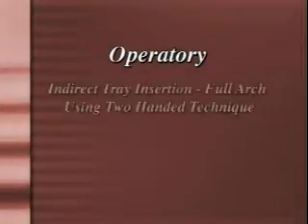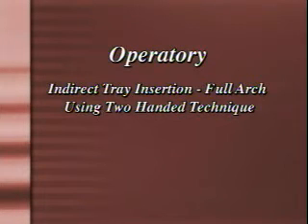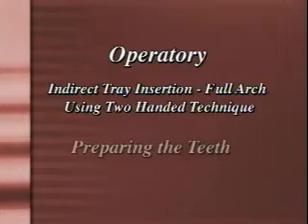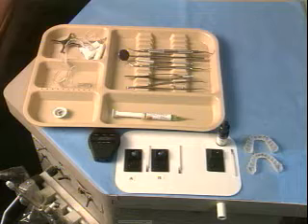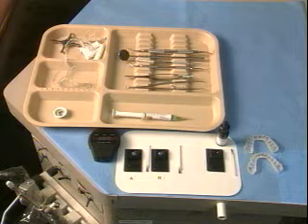Operatory. Indirect tray insertion. Full arch using two-handed technique. Preparing the teeth. This is a typical tray setup for an indirect bonding procedure.